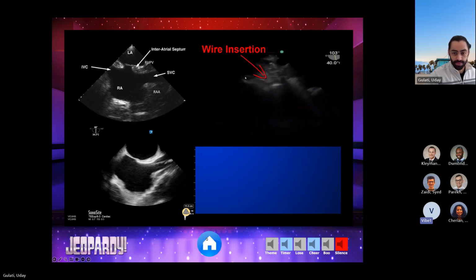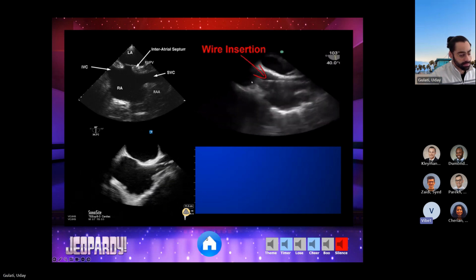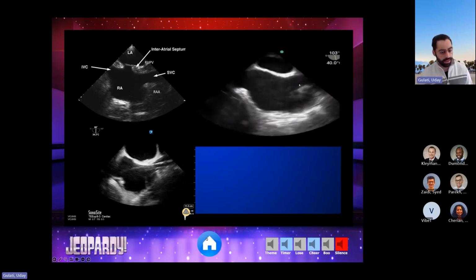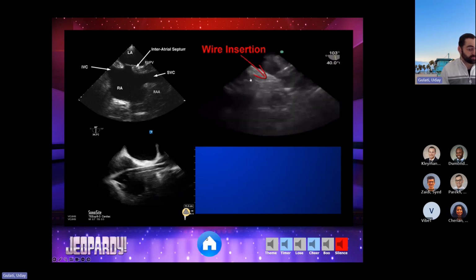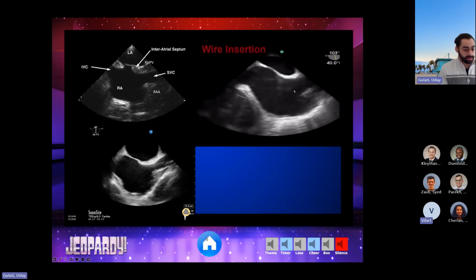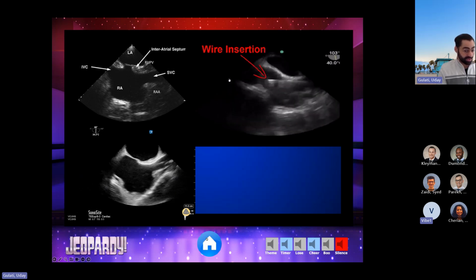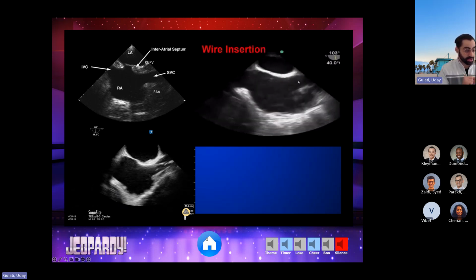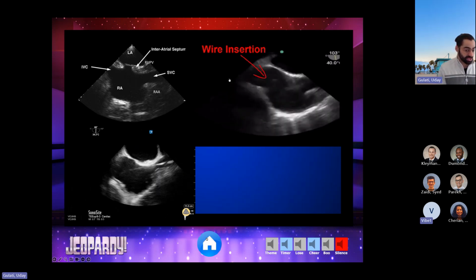Any chance you know what the general measurement would be for the wire? The general measurement of how deep you're letting that wire travel up? Yeah, so it really depends on the catheter you're inserting, right? Sometimes you may just be doing femoral, but if you're doing femoral and IJ, you just want to see that wire go into the superior vena cava, because then you're going to measure the superior vena cava atrium junction and then the inferior vena cava right atrium junction. So if that wire goes to the right atrium, that's fine, and then I know that the catheter is in place, but I'm not going to be advancing the catheter all the way into the right atrium. I'm going to keep it at the junction. So I'm going to take that wire.